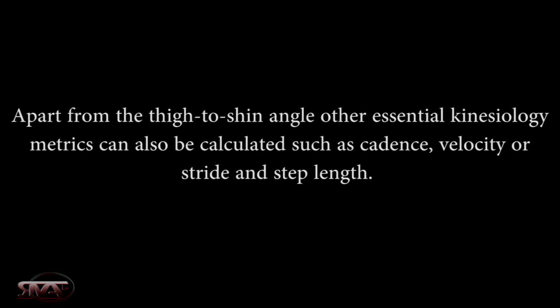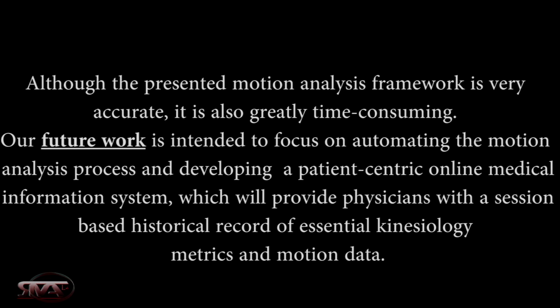Apart from the thigh to shin angle, other essential kinesiology metrics can also be calculated, such as cadence, velocity or stride, and step length. Although the presented motion analysis framework is very accurate, it is also greatly time-consuming. Our future work is intended to focus on automating the motion analysis process and developing a patient-centric online medical information system which will provide physicians with a session-based historical record of essential kinesiology metrics and motion data.